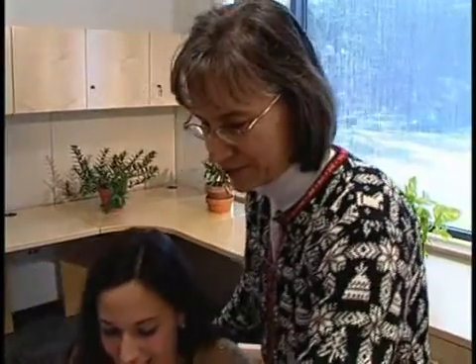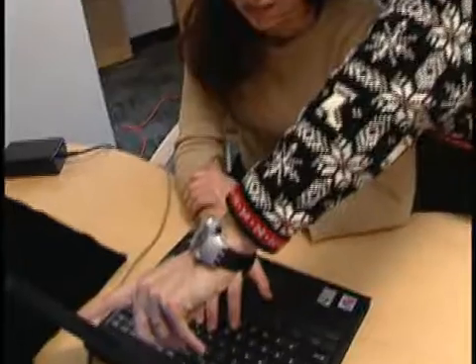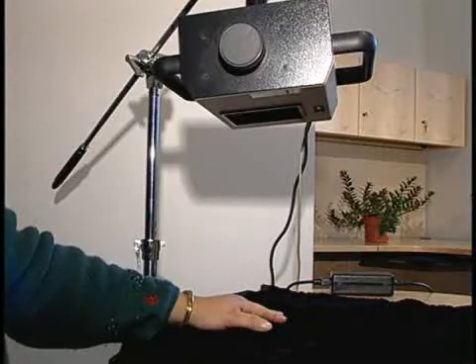So we're checking out the slightly warmer digit, the warmer wrist. The thermal scanner detects temperature differences. Inflamed joints are warmer, the first sign of arthritis.